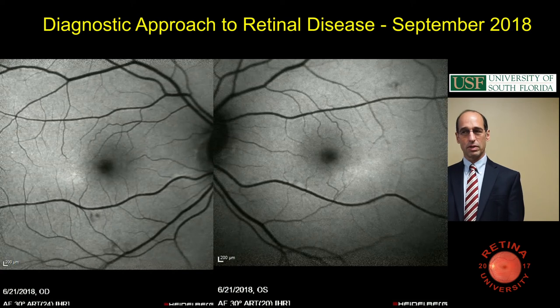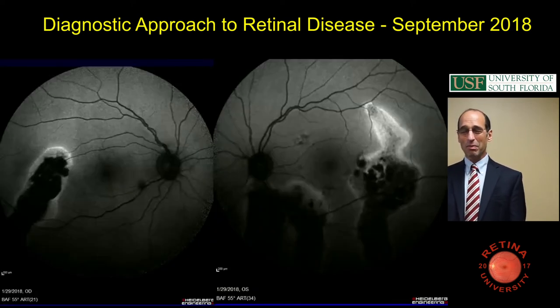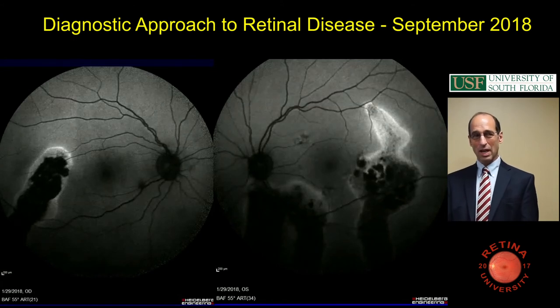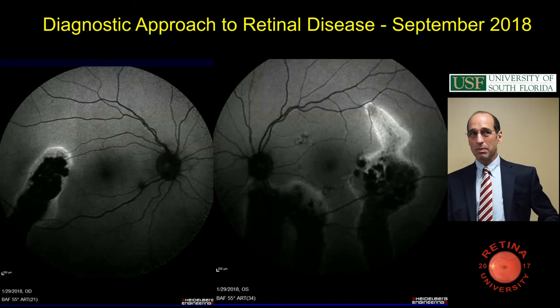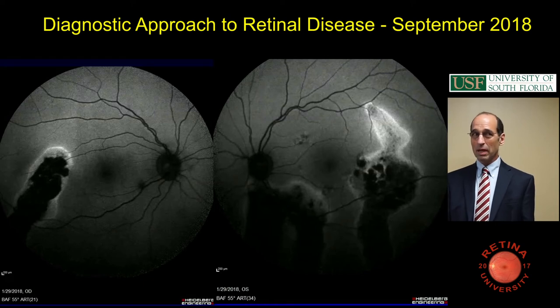Now we mostly get OCTs. Autofluorescence you have to dilate people for, too. I have to say, with my OCT scans being as good as they are, I don't dilate people a lot of times now. Even my AMD patients, if they're coming in for treatments and a scan, I don't need to dilate them. I dilate people probably twice a year, maybe. Yeah, it's easier. The visits are quick. It's nicer for them.